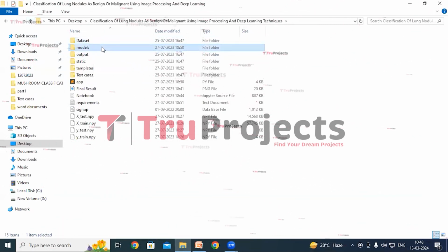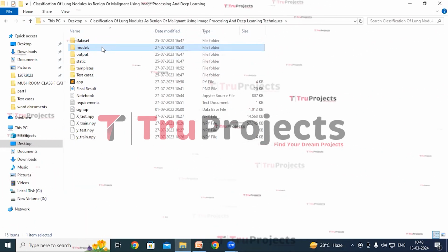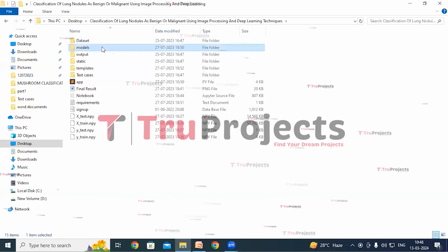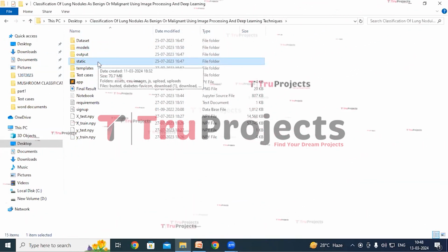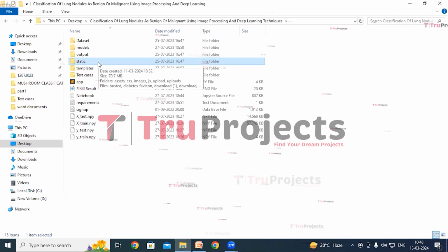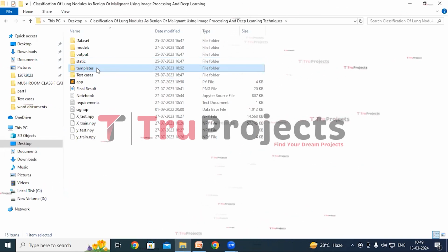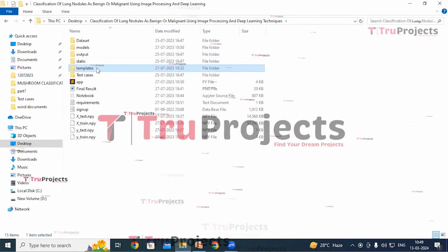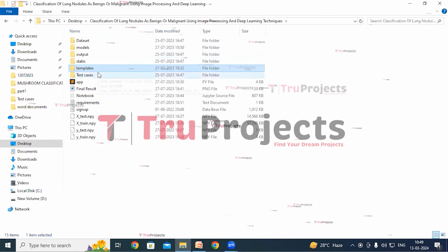This is models folder in which I have model files which contain algorithm information. These files will be loaded into the project code during runtime to utilize the trained models. This is static folder. This folder consists of files related to CSS, JavaScript and Bootstrap. This is templates folder. This folder contains all the HTML pages used in the project. It typically includes files like index.html, about.html, etc., which represent different pages of the website.